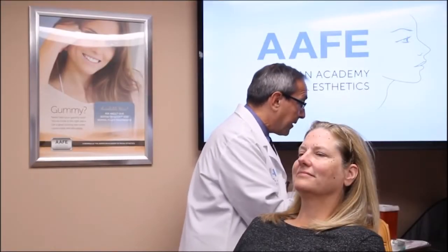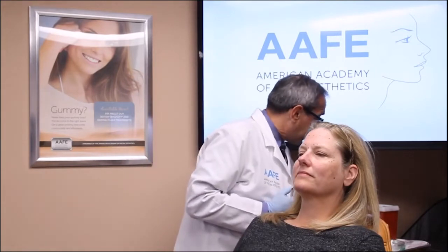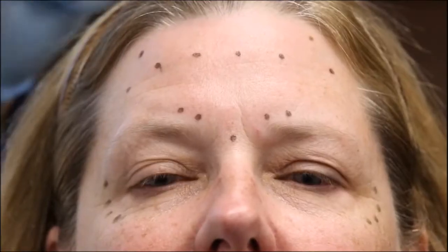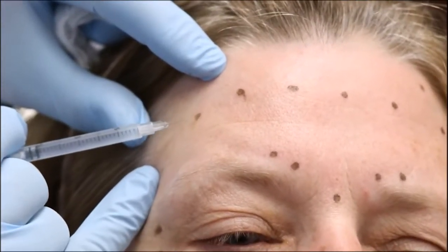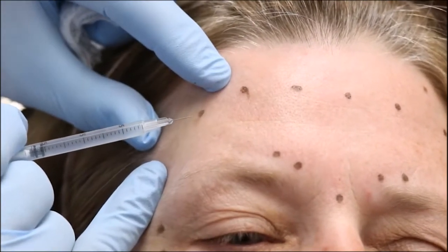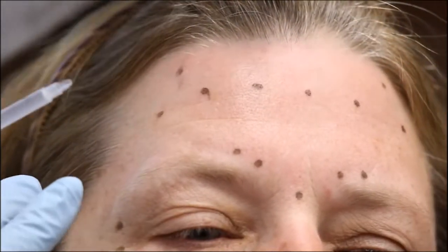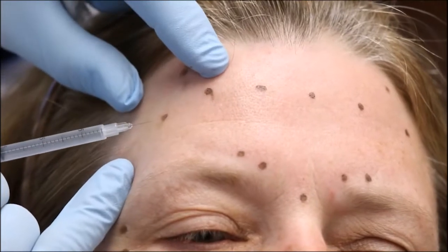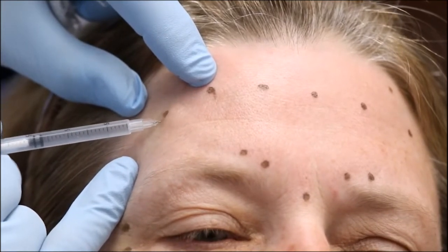We're ready to go ahead and start giving her some botulinum toxin. We've already drawn it all up, so let's focus on the forehead first. You're going to feel a couple of quick little pinches. We're giving her a range — because every patient is different, I don't want you to be a cookbook injector — anywhere from 10 to 12 units of Botox on this one right here.